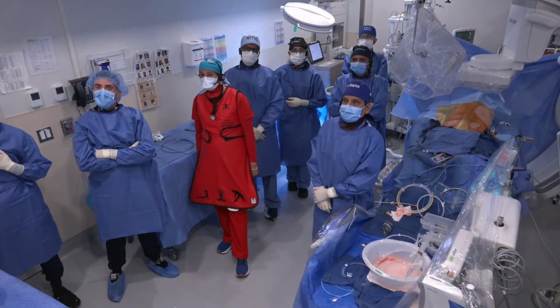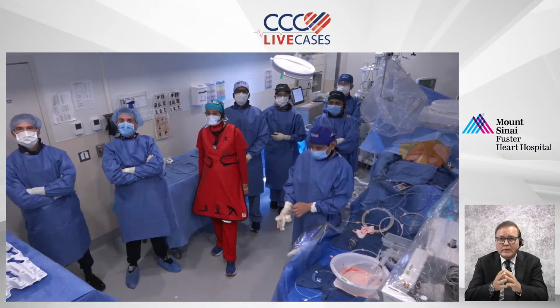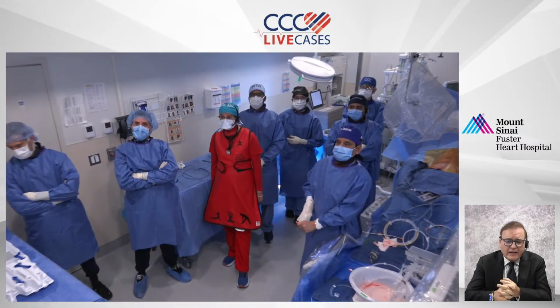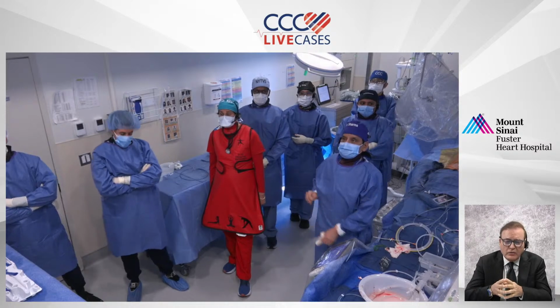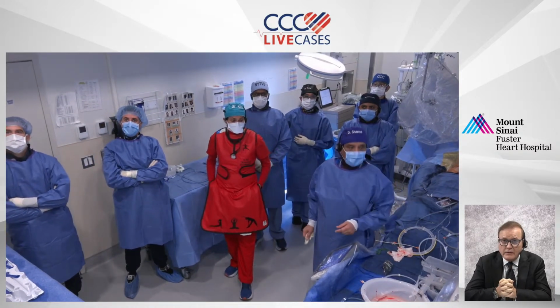Before we move on, there are 2 more questions about PVR. The first one is how to quantify PVR in the case of multiple leaks along the circumference of the TAVR. I don't know if Dr. Lerakis is still there. Lerakis is there, yes.